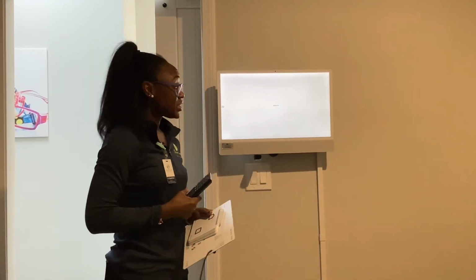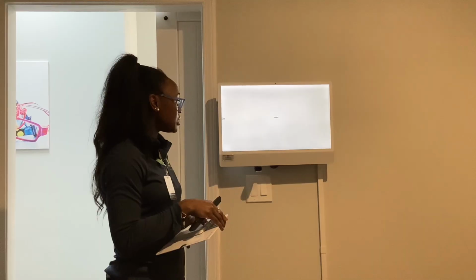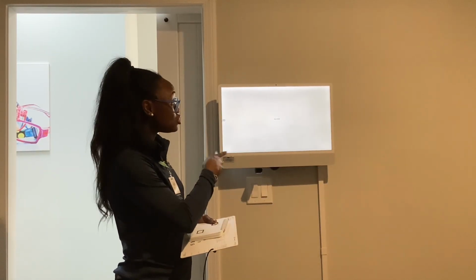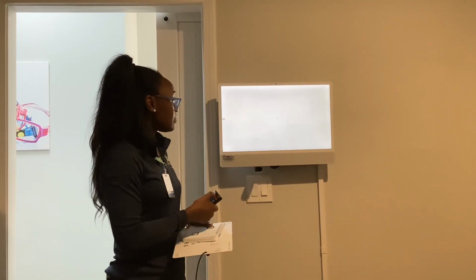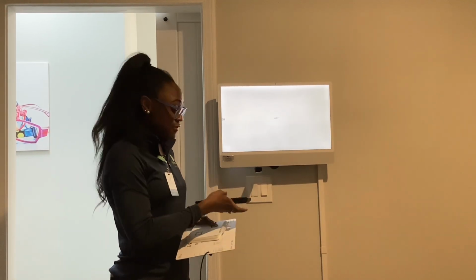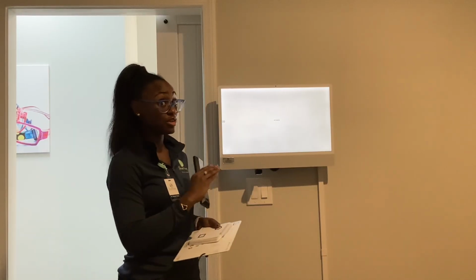This is 20/20. If they only get 2 letters, okay, we now show the full line. Let's say they only see the E and the B. This means that their visual acuity is 20/25 plus the 2 letters on the 20/20 line. Let me repeat that. We have an isolated letter, is G. They see it correctly. We now show the full line. They only see H and U. Visual acuity in that eye is 20/25 plus 2 because they only got 2 right on the 20/20 line, correct?